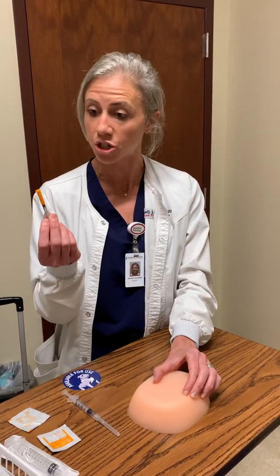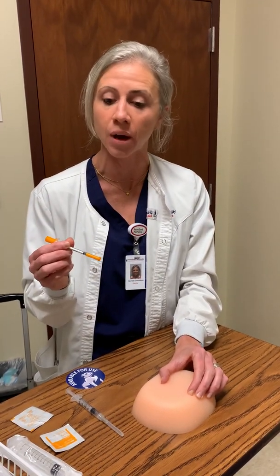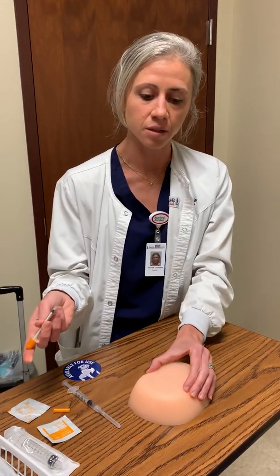Now here's a problem: I wanna make sure that before I remove the cap, I have everything, that my dosage is right, that I've got everything prepared before. Once again, I always do that second check before I'm going to dart the medicine, okay? So I'm going to make sure that I've got my Lovenox syringe ready. I'm going to take the cap off. I'm going to pinch the skin, okay?